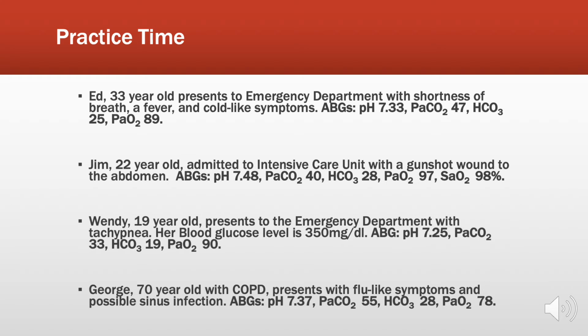In this case, a pretty short time ago, probably maybe an hour or less, George was actually probably in a state where his pH was low or acidotic. So we're going to give that pH a downgoing arrow, and we're going to compare those arrows to one another just like we have in the past. We'll in this case say that we have respiratory opposite with a pH with a downgoing arrow and a CO2 with an upgoing arrow.